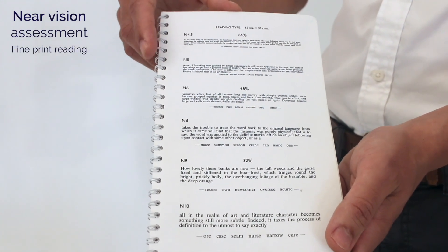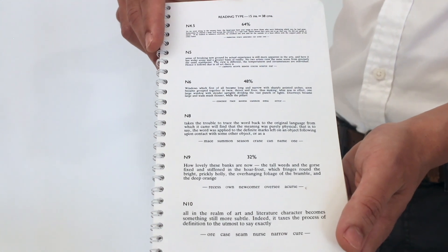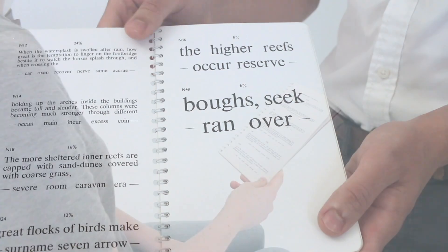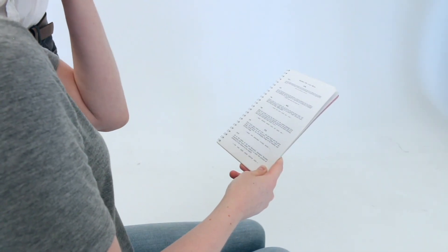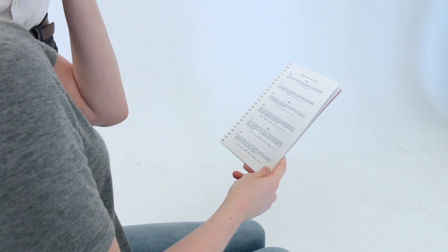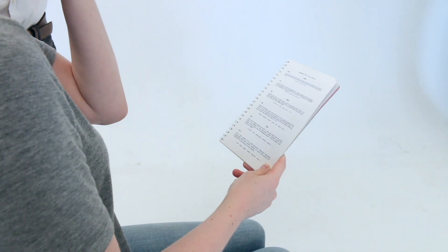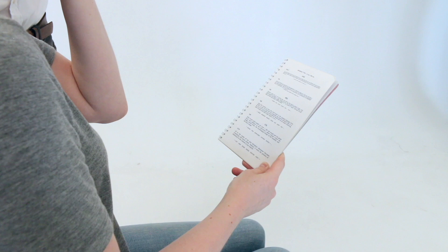Now I'm going to test your near vision. If you just read the smallest line that you can — if you can't read anything on that page then we'll test with the other page. So if you could cover up your left eye for me please and read the smallest line that you can at arm's length with your right eye: "Sense of breaking new ground by actual experience is still more apparent in the art, and here it has wide escape and a greater basis of...".